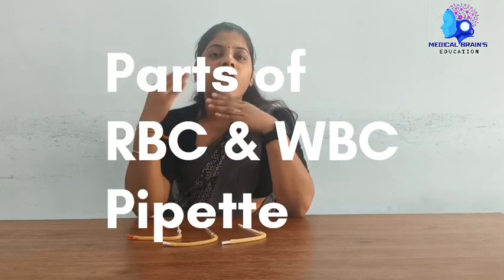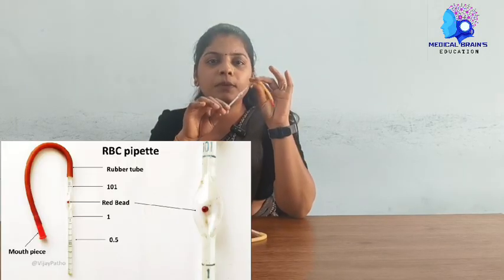But in this video, I am going to discuss what the parts of RBC and WBC pipettes are, and their differences. Come, let's see what the parts of the RBC and WBC pipettes are. The first is the RBC pipette.